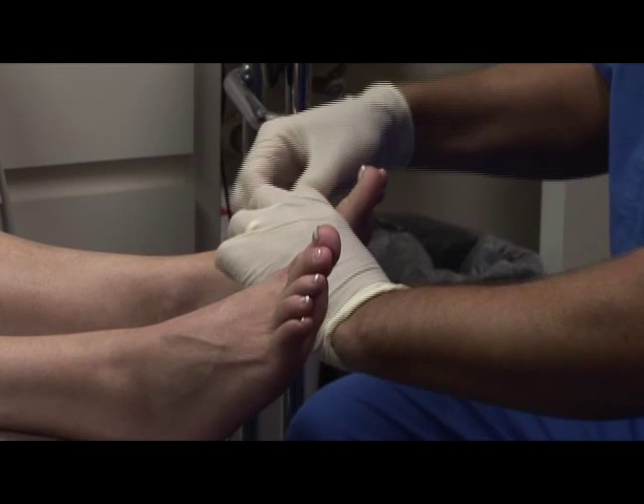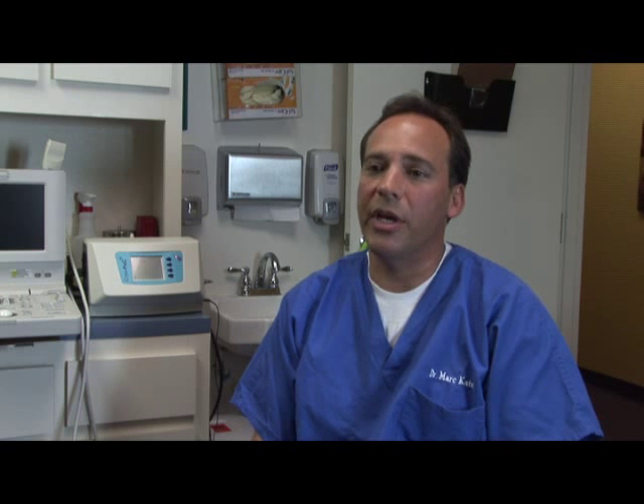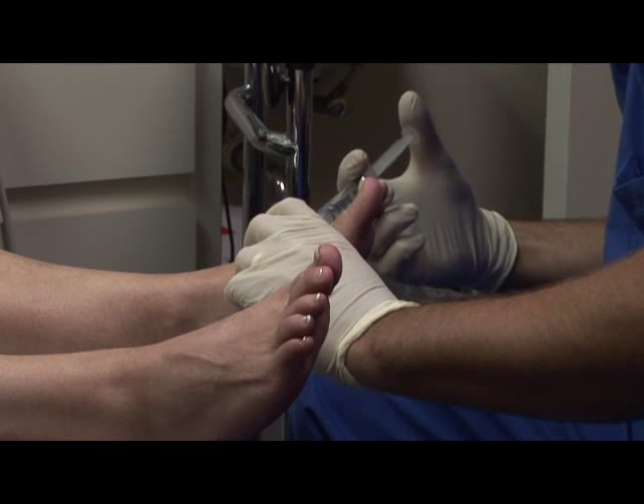Before the procedure, the patient will come in. What we'll do is we will actually find the source of pain and we will mark that area. In addition to that, we'll do a diagnostic injection. Once the patient has confirmed that that is the effective area of pain, we'll then know that that's the spot that we're going to be treating.